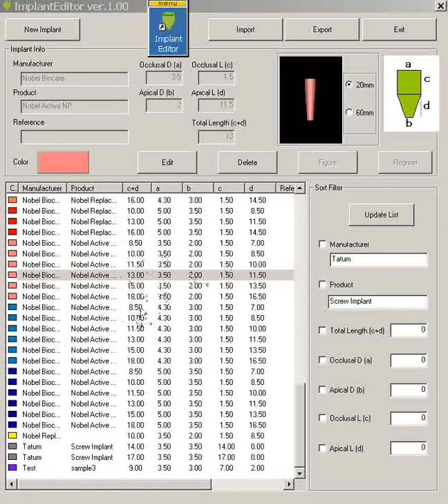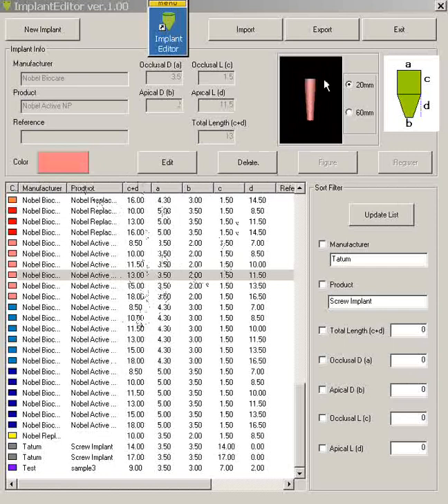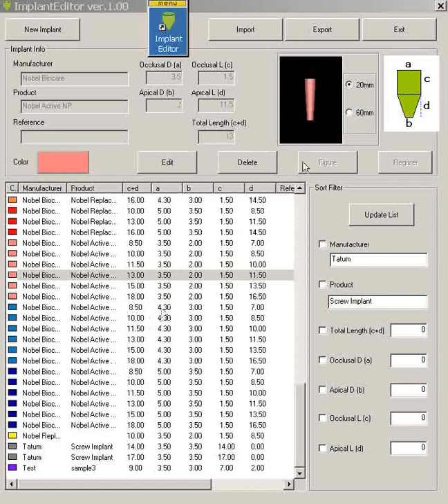Now remember these are just shapes. They're not the real implants like you would see with the grooves and the threading. So it's just a shape to substitute for just a straight linear line when you're doing your measurements. These are shapes that will correspond extremely close to your particular implants that you wish to register.